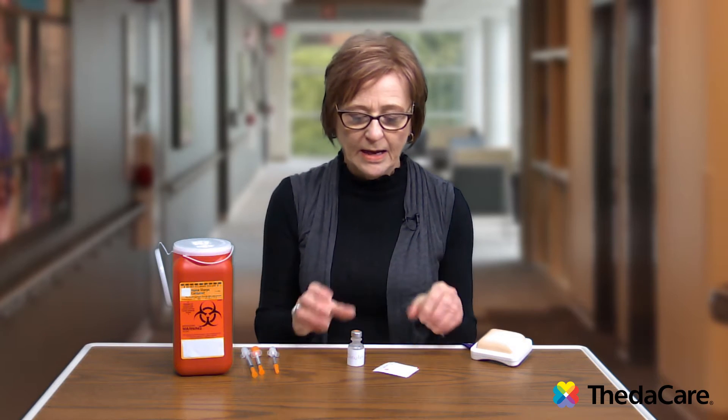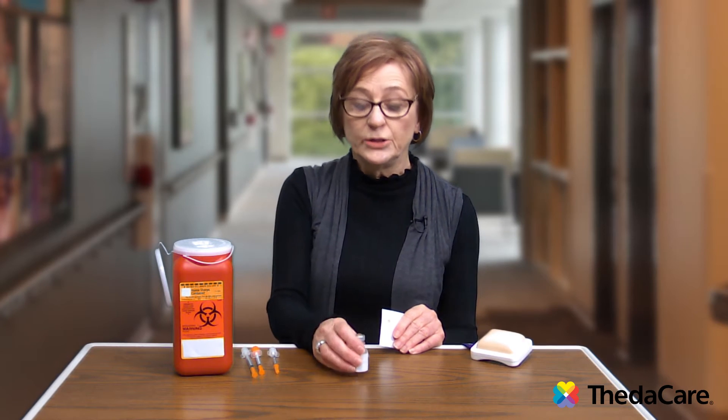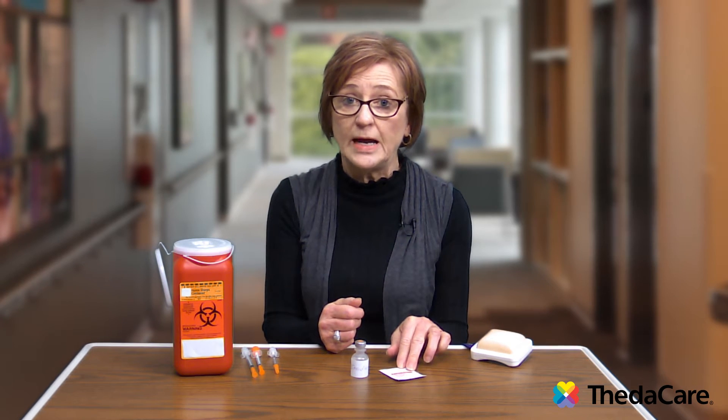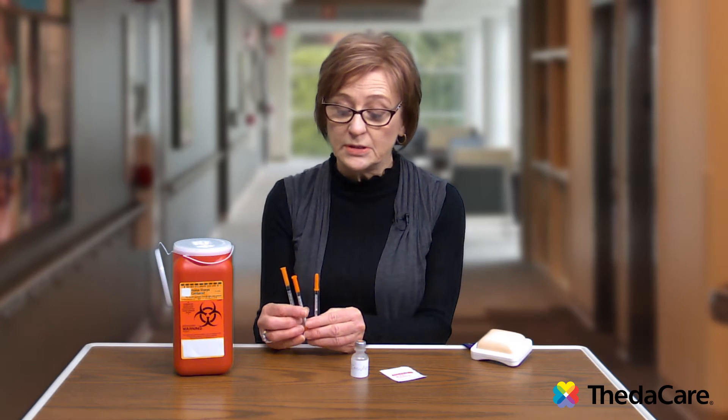Different types of insulin have different expiration dates. To prepare for the injection, you first want to make sure that your hands are clean, and then get your supplies ready. What you'll need is your insulin vial, an alcohol swab or rubbing alcohol with cotton balls, and a specific syringe meant for insulin use.